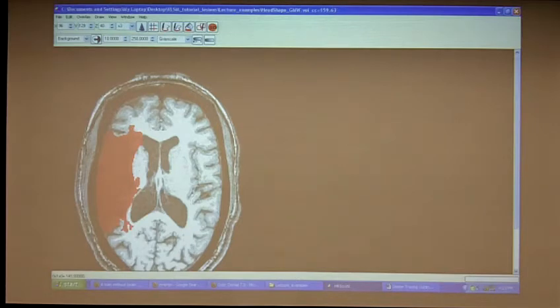About the downsampling, do you do that before or after you draw? Before, so that there are fewer slices to draw. Okay, that's what I thought. One of the ways when you're clinically looking at an MRI and trying to bring out lesions is to adjust the brightness and contrast. Do you ever play around with those settings? I don't. I just take whatever I'm given.